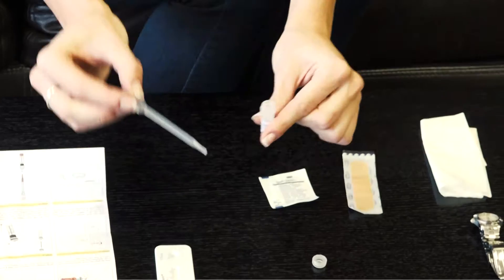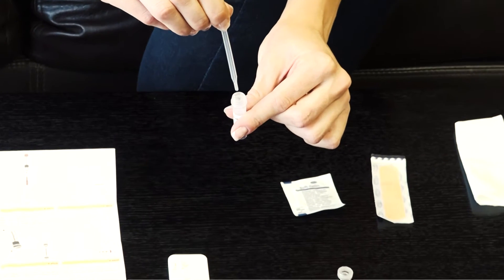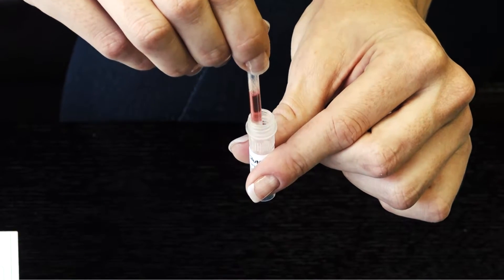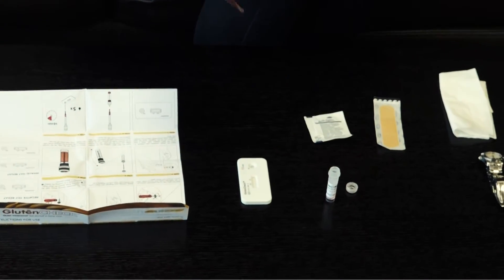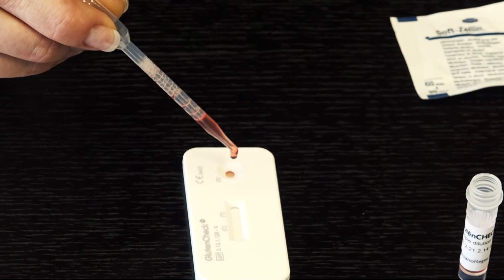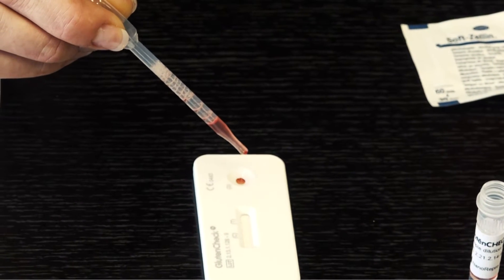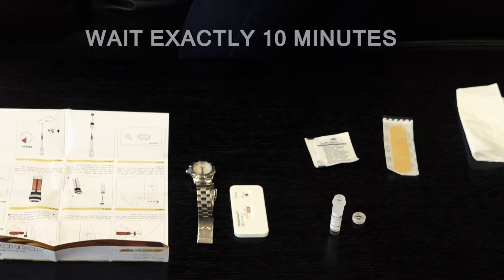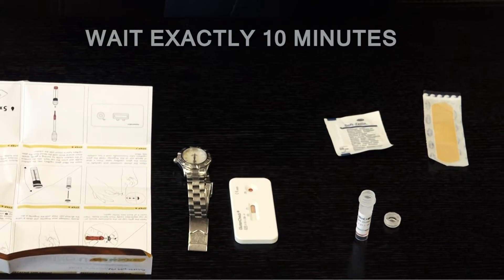Step 8. Insert the pipette into the solution bottle and add a few drops of the sample mixture. Hold the pipette with the sample mixture straight up and down over the test cassette and squeeze gently to add exactly 5 drops to the sample well. Please wait exactly 10 minutes after adding 5 drops to the sample well, then read the result.